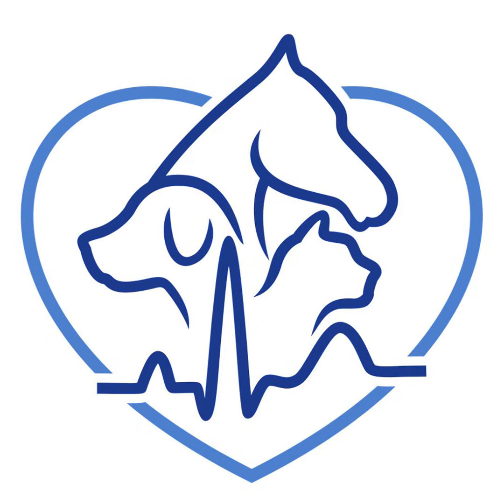Even when we are able to acquire it, portions of the left ventricle are artifactually obscured, right? There's a rib in the way, or there's lung. We're really not practically able to get it unless the cat is heavily sedated, and that's going to affect some of those values anyway.